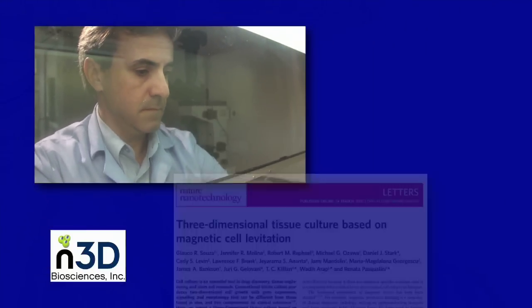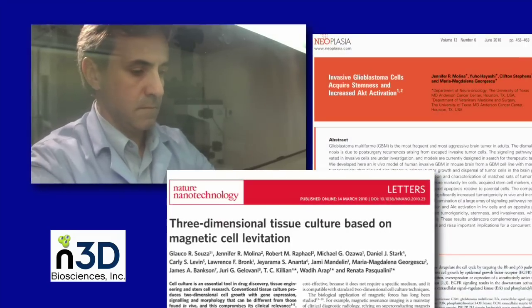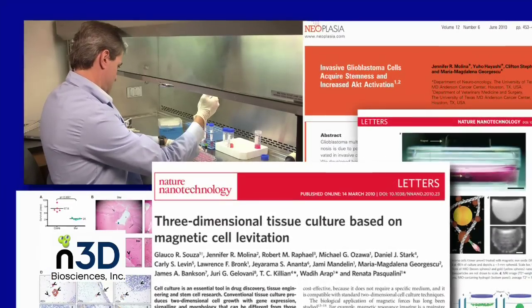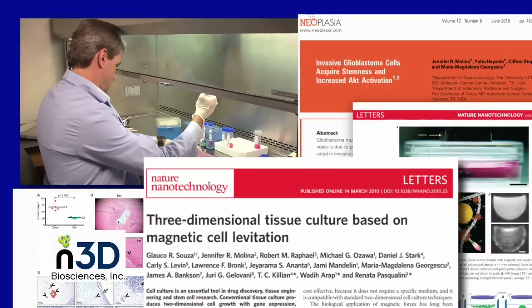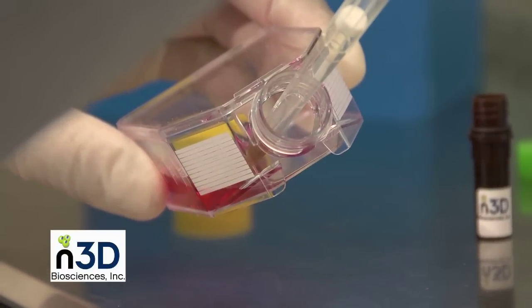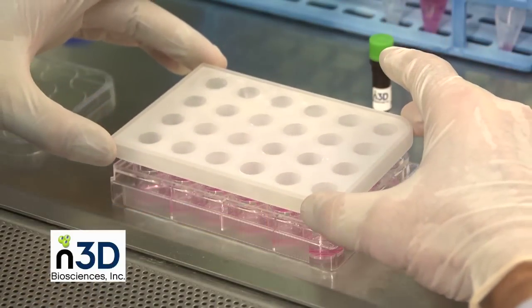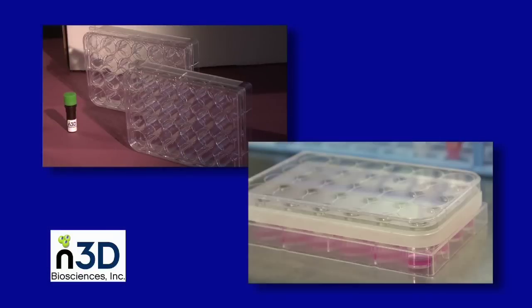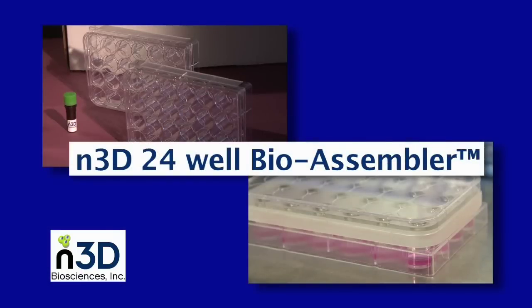Dr. Glauco Souza, Chief Science Officer of Nano 3D Biosciences and lead developer of the technology, demonstrates how easy it is to grow cells in three dimensions using the Nano 3D BioAssembler. Nano 3D customers are always amazed when they learn that they can grow 3D cultures of virtually any cell type by adding only two simple steps to their standard 2D culturing process. Here we'll grow 3D cultures with our 24-well BioAssembler. The process is similar regardless of the well count.